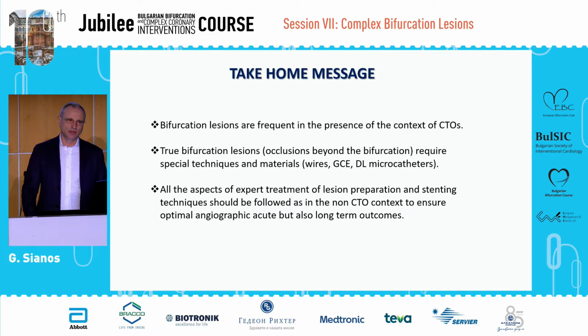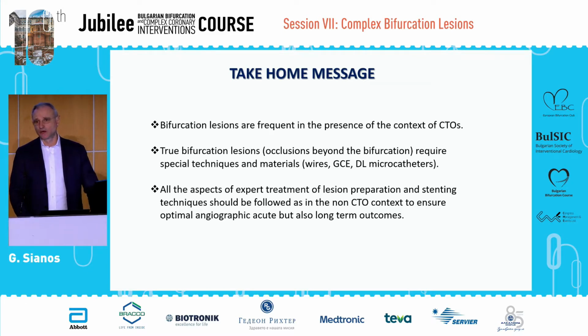So I showed you some of the scenario and some of the complexity. There are even higher levels than that. But the bottom line, if I have to give a message about this complex topic, is that bifurcation lesions are frequent, or not infrequent, in the context of CTOs. Someone who is doing this at a high level has to be prepared for that.